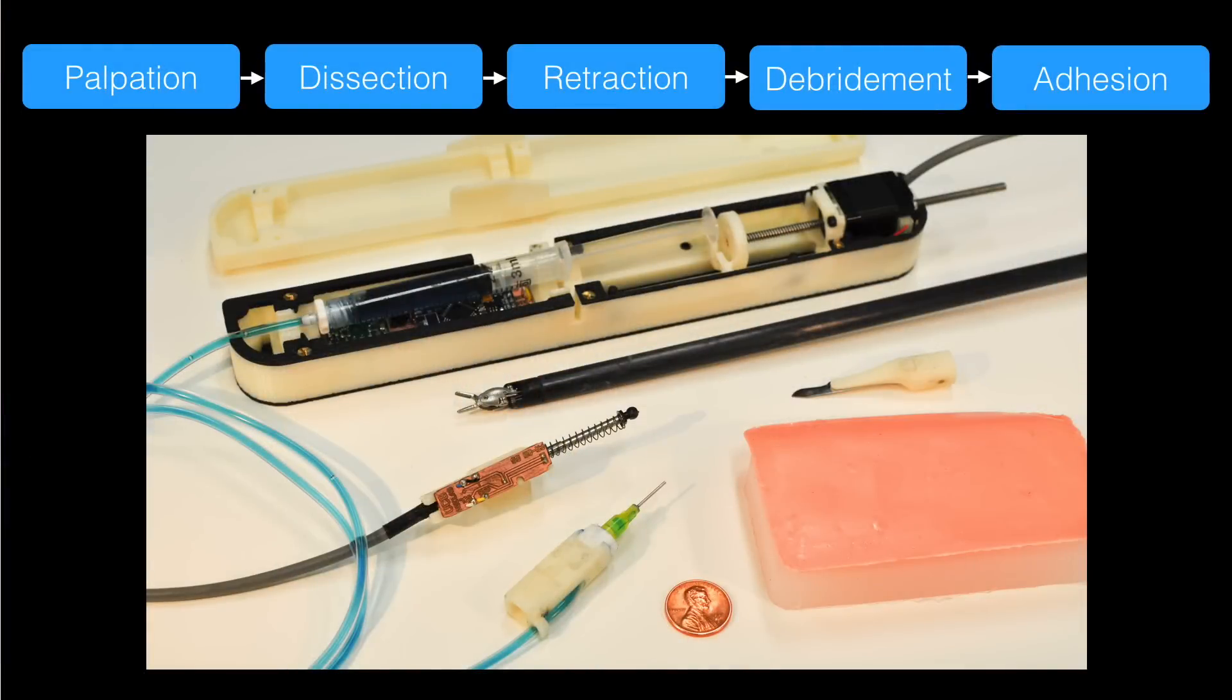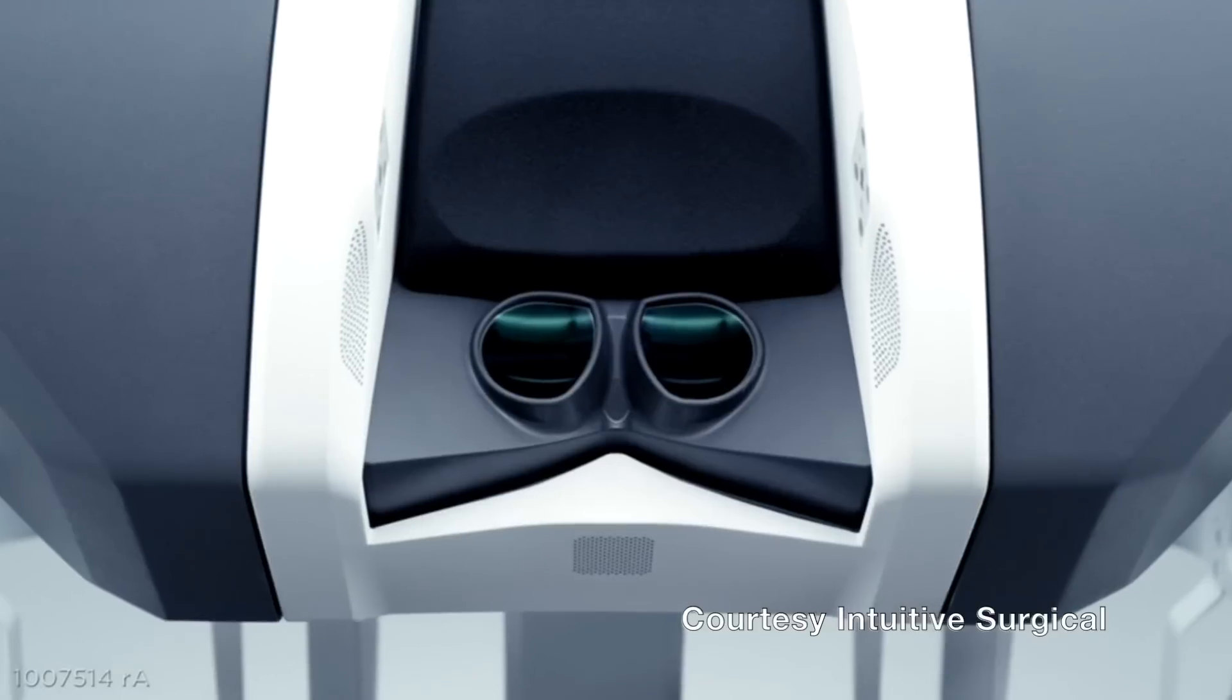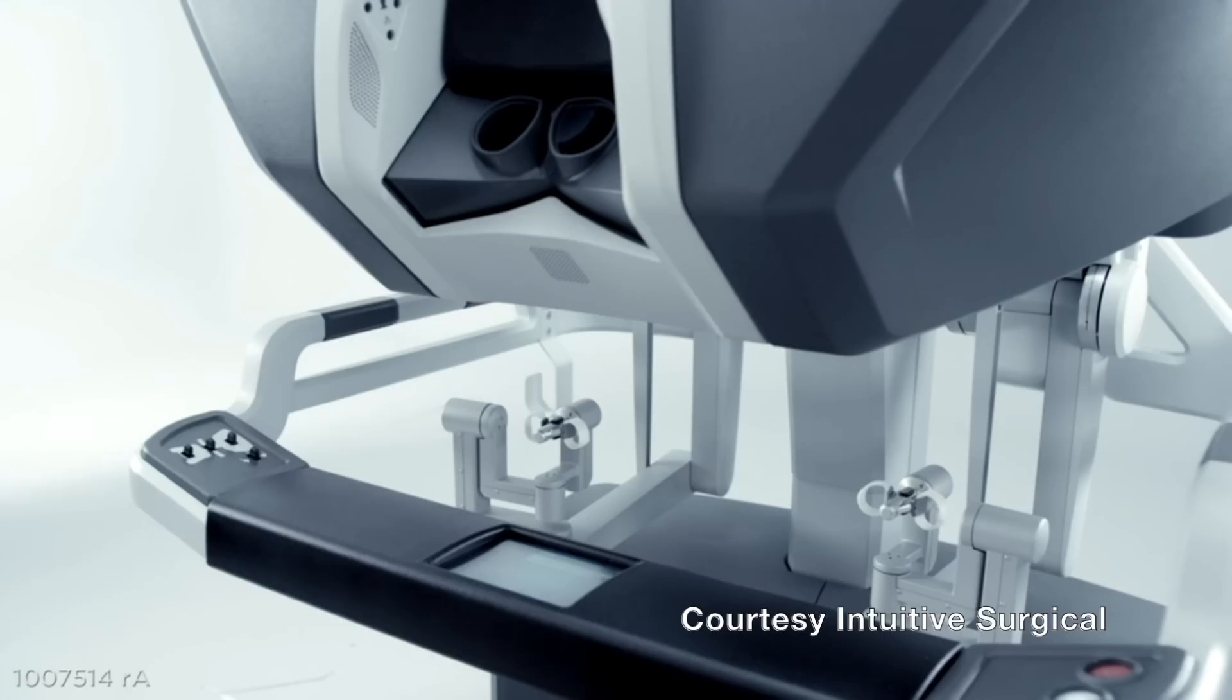We have created tooling and software to autonomously perform a multi-step surgical procedure, including palpating to localize a subcutaneous tumor, dissecting and then retracting the skin to reveal the tumor, reaching in to extract the tumor, and sealing the incision with surgical adhesive. Each of these steps is performed without human intervention.